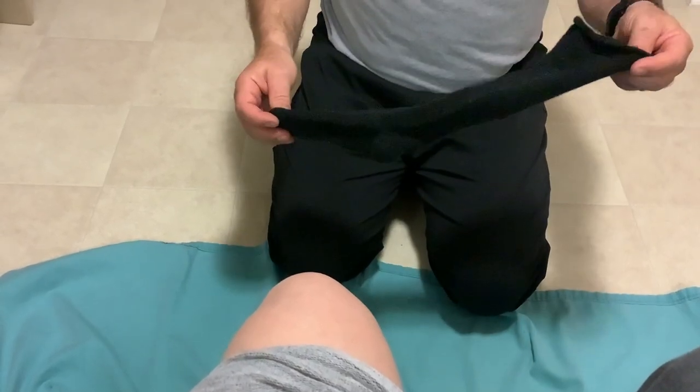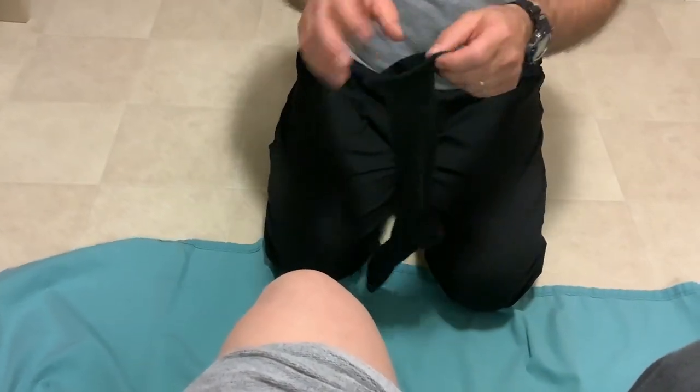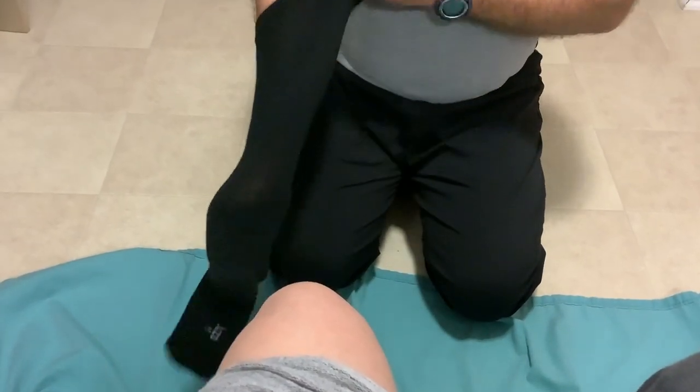Today we're going to talk about using the Juzo Velcro Wrap and how to adjust it properly. We're going to start with the compressive sock. Reach inside, grab the heel of the sock like a sock puppet, and fold it inside out.